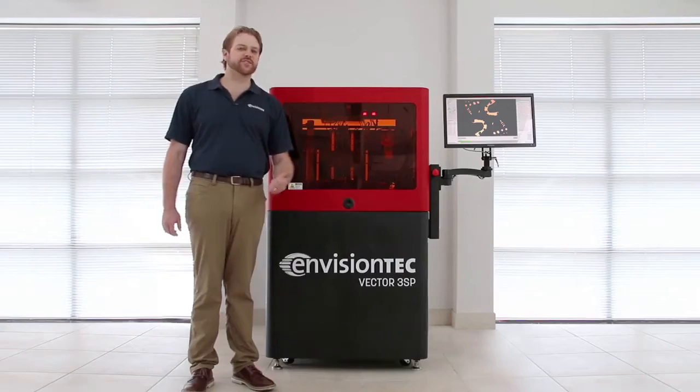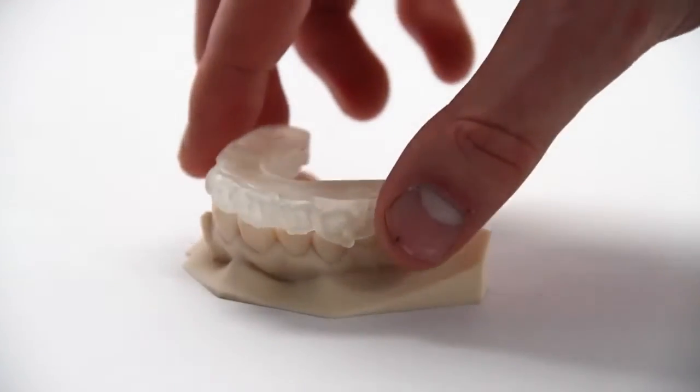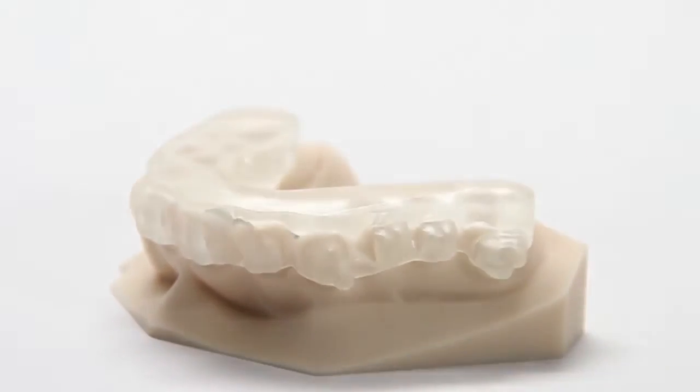3SP stands for Scan, Spin and Selectively Photo Cure. This yields some of the most accurate 3D printed models currently available for the digital dental and orthodontic laboratory.